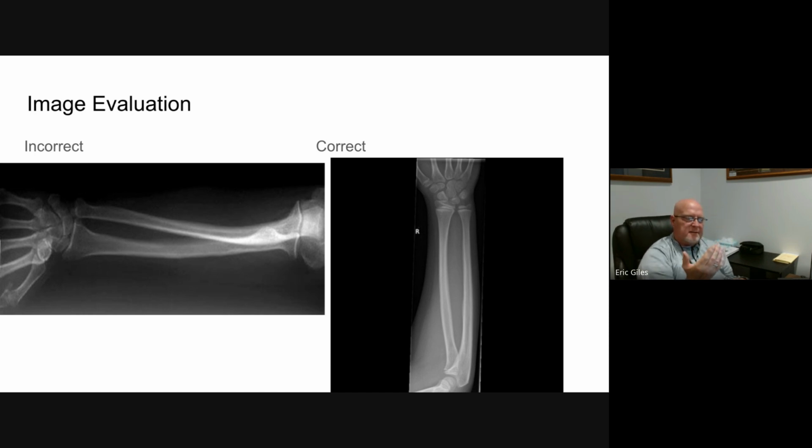Okay, now we turn that image up. Now, how do we want that to look? Okay, we want that to look straight up and down, but we want the right to be on the right and the left to be on the left. And actually, you know, I'm sorry, but I made a mistake. So this one is not correct. This one is actually turned backwards. So it's going to sit in front of you in an anatomic position. So the thumb needs to be on the right side. So that image has to be flipped to be anatomically correct. Okay, sorry about that, guys. And if I could flip that image, I sure would. I can't. Hey, let's move on to an elbow. Just remember, fingers, hand, wrist, forearm hung from the fingers, right?